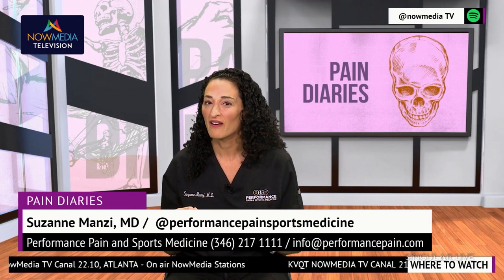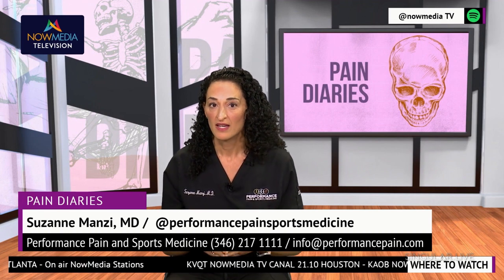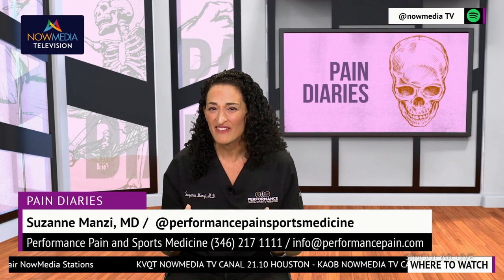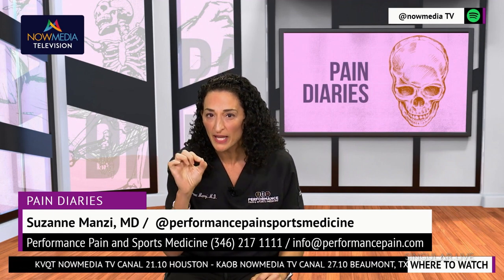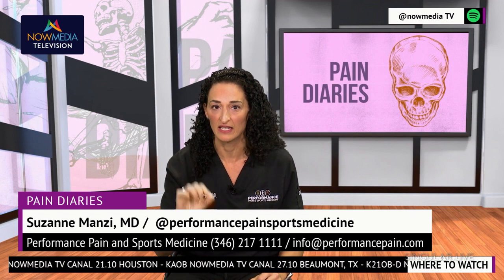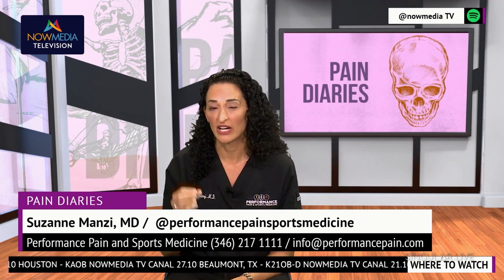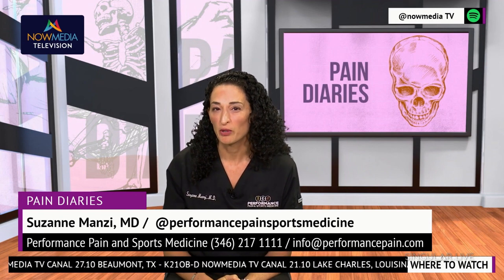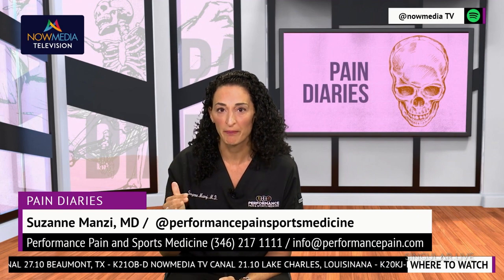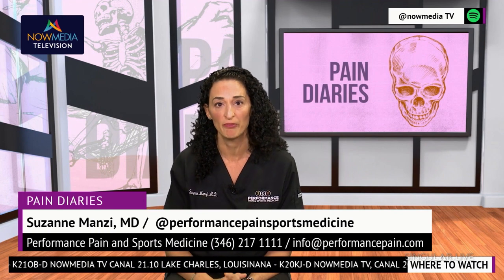So let's talk a little bit about how spinal cord stimulation actually works. Spinal cord stimulation is an innovative and effective treatment for chronic pain, and the procedure actually involves the implantation of this small device under the skin. It goes near the spinal cord, and then the device is connected to wires that carry electrical impulses to the nerves in the spine. These electrical impulses help disrupt the pain signals that are transmitted all the way to the brain, reducing the sensation of pain.